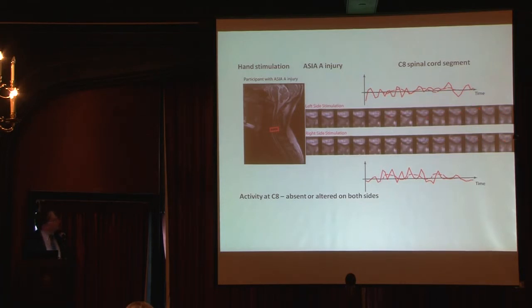You can see it's still affected. We're a little bit too high for this. We really don't see much activity. There's a messy pattern. We do see areas that are along the edge of the cord. So it's very questionable if there is any activity at all. So I'd say this is really absent or at least altered. I wouldn't put too much faith that this is actual activity. It looks like we're not detecting any activity on either side here.